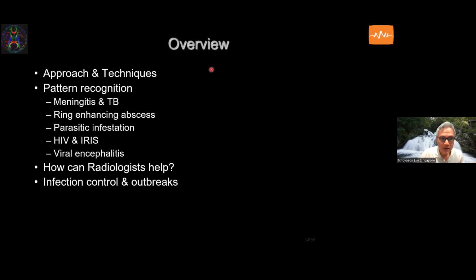I'll talk a bit about the applications and techniques in CNS infections and launch into a superficial coverage of some of what the radiologists use image pattern recognition to make diagnosis of the common patterns of infections and the features that we extract from the images, including meningitis, particularly TB, because that may be of interest worldwide.